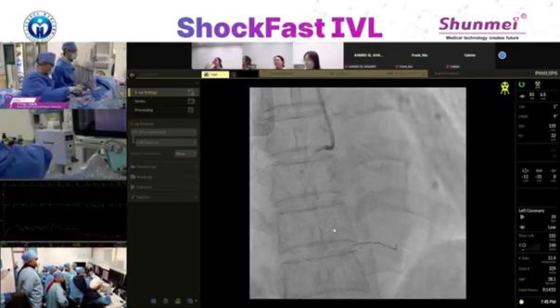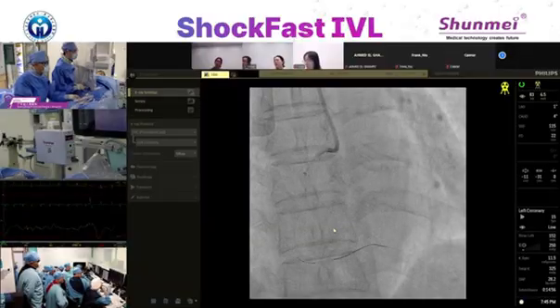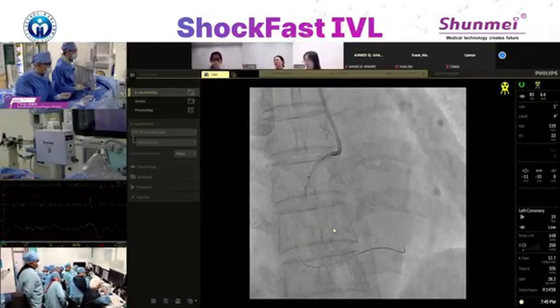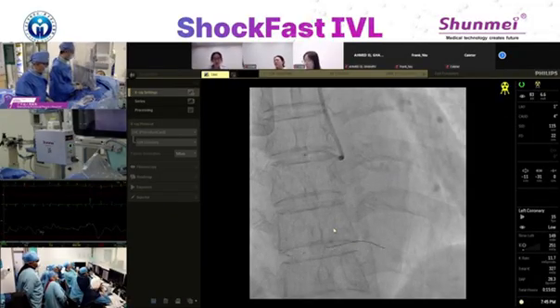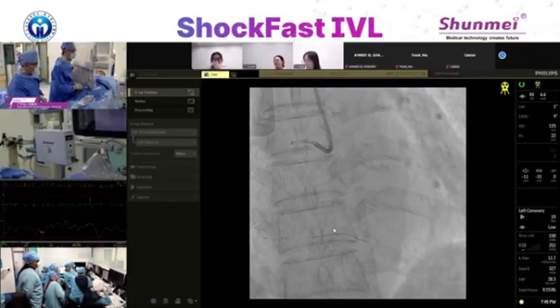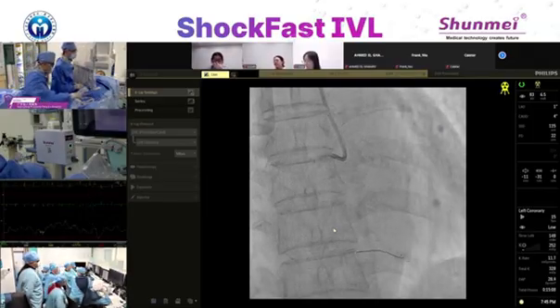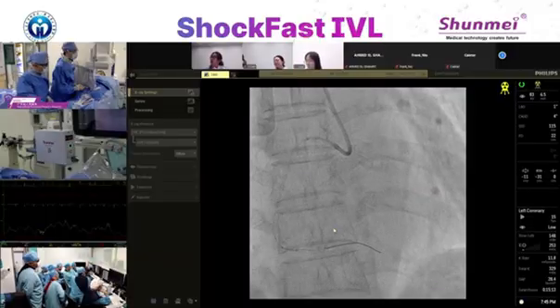Okay, I'll just go a final try. Deliver my IVL balloon. If I can get cross, it's very good to shock it.